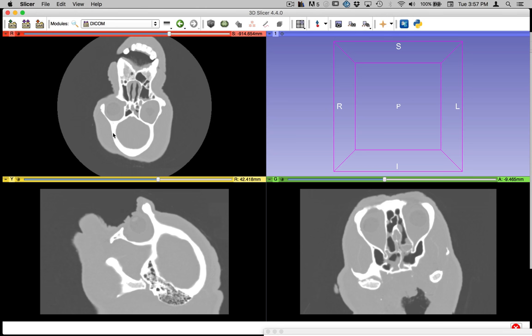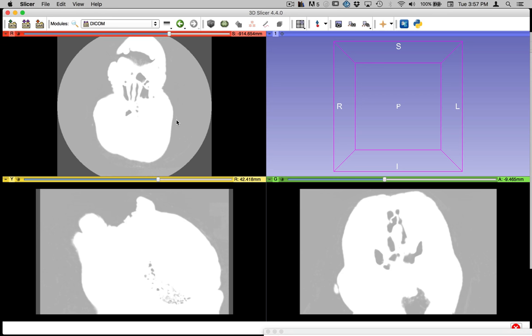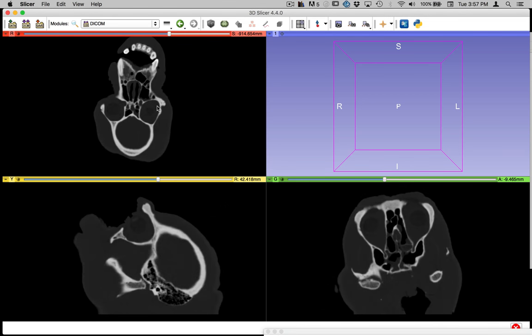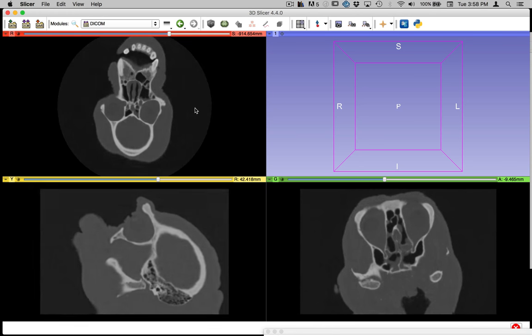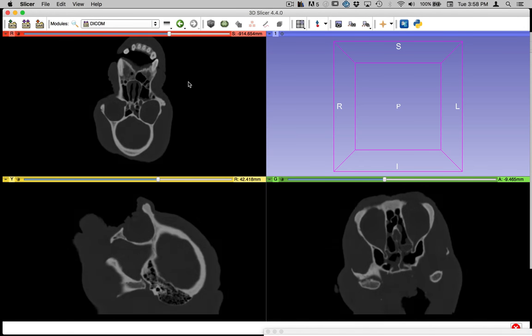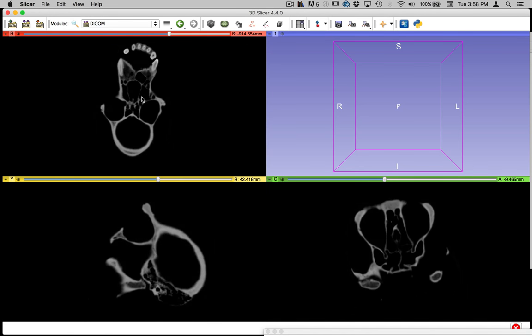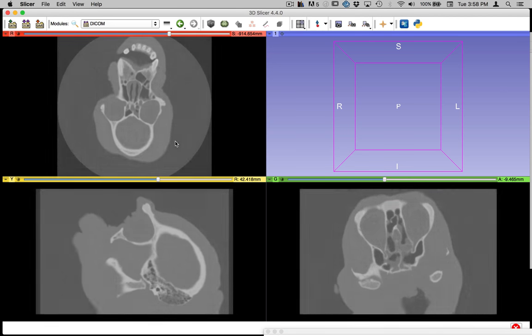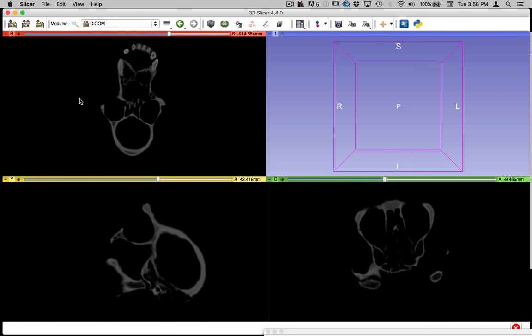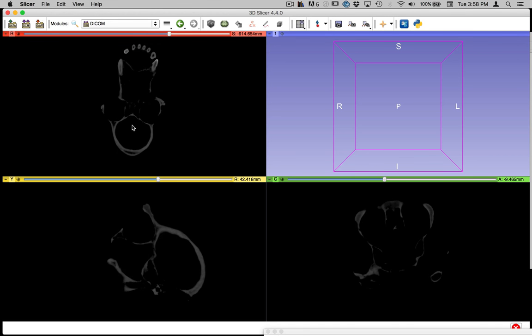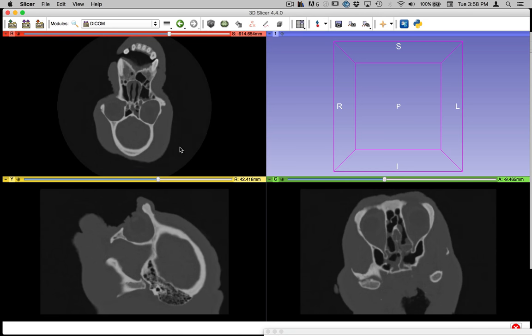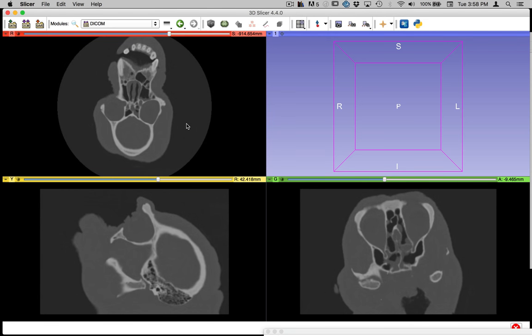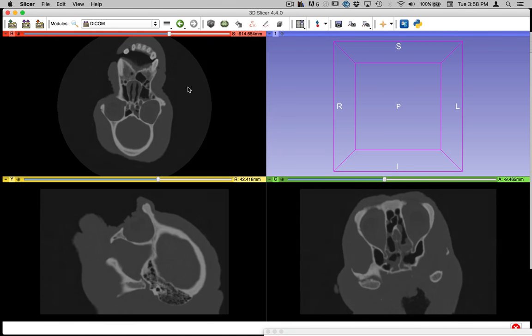So when you are in one of these windows, if you left mouse button and drag down, you can increase the brightness, drag up, you can decrease the brightness, and left and right works with contrast. This is not changing your images in any way. It's just changing your view of them. So if I'm trying to pick out areas within the bone, I can see parts of the cancellous bone inside the solid table of bone around them. I can work with the contrast just to try and pick out that detail. Now, extracting that detail is a different story, and we'll look at that in a bit.